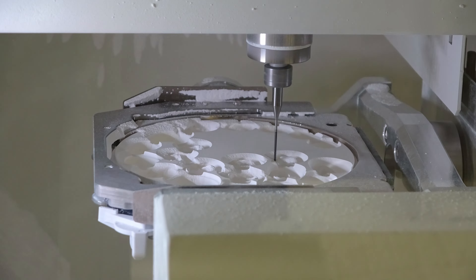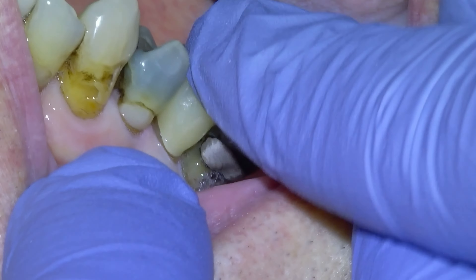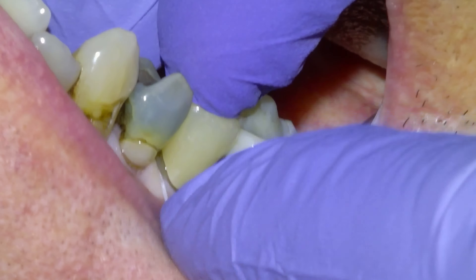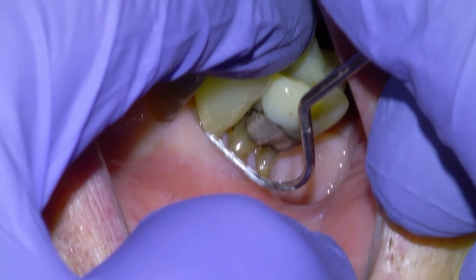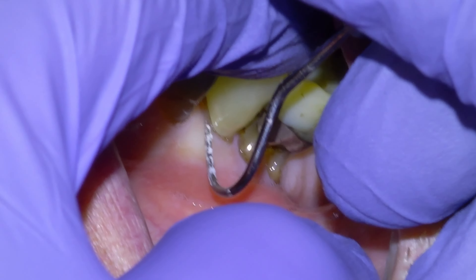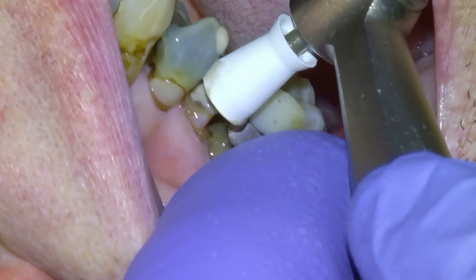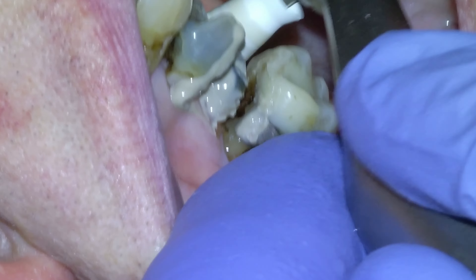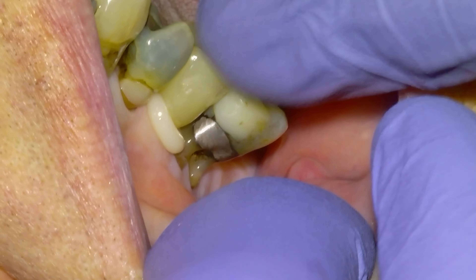I'm going to nest it in the Roland 52D and then send it to mill. We'll get the patient back, try in the crown as a dry fit to make sure we're happy with the interproximal contacts, that the margins are crisp, and that the bite is comfortable. Make any adjustments, then take it off, prime the surface, pumice the tooth, and cement it with Panavia SA.